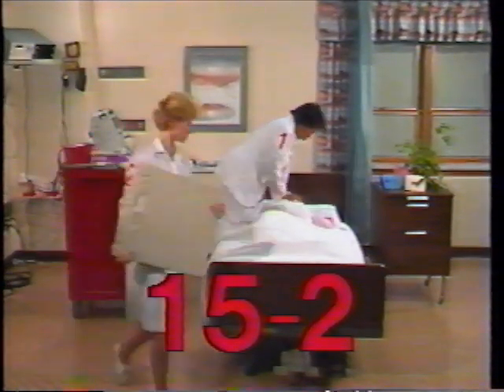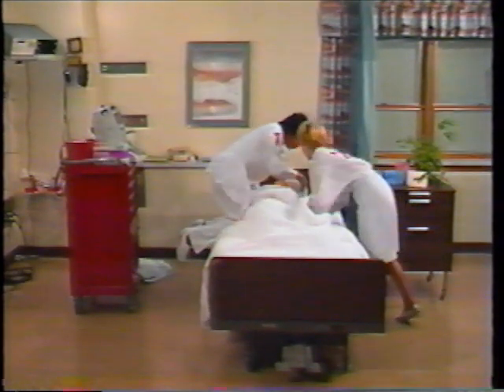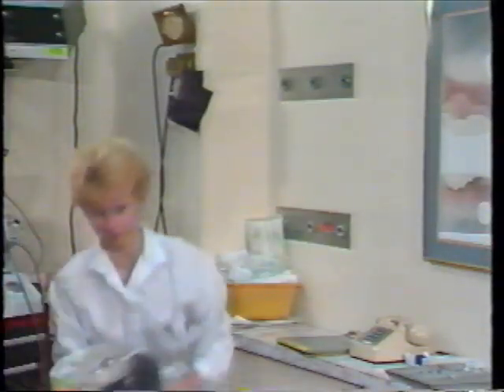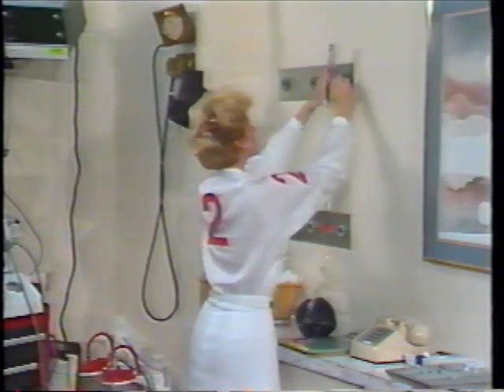Once the crash cart is in the room, nurse number 2 places the backboard under the patient. She then sets up the O2 to deliver 100% oxygen. She will also connect the suction and make sure it functions properly.